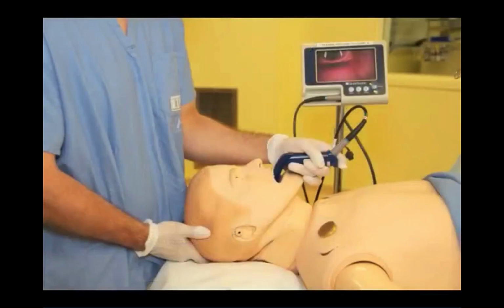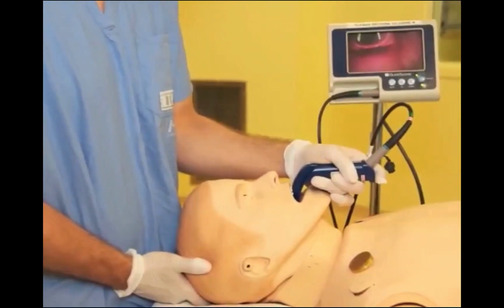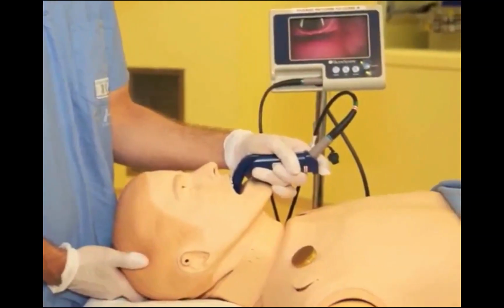Whenever performing an intubation, ensure the audible pulse oximeter tone is enabled. There are 4 important steps that must be completed to avoid patient injury when intubating with the Glidescope. The first step is to look directly into the patient's mouth to place the Glidescope blade. The second step is to look at the monitor to confirm glottic visualization and fine-tune the placement of the blade.